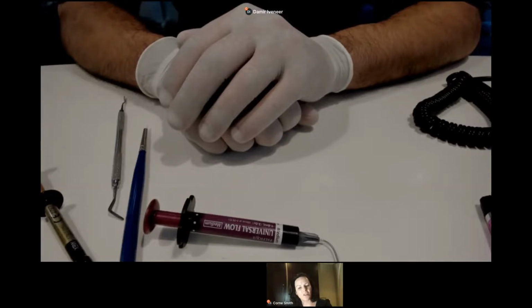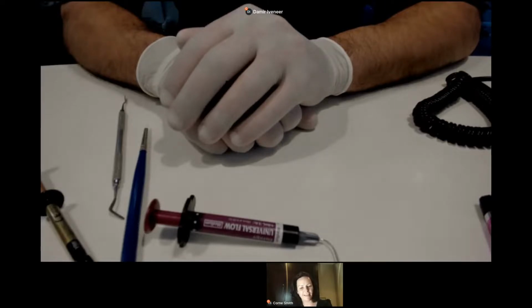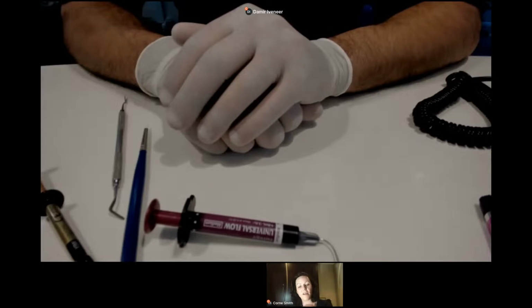So when we treat worn teeth, we can't lengthen teeth irrespective of what the occlusion allows us to do. We have to understand what the occlusal limitations are. So my suggestion is really, when you start using iVeneer, don't just lengthen teeth. Start with a case where you don't need to actually add anything. Don't start with a worn dentition case. Start with a case where the length is probably going to stay the same. That's a very safe way to start with iVeneer, because you don't want to start with something that's quite tricky to manage on a completely different level.